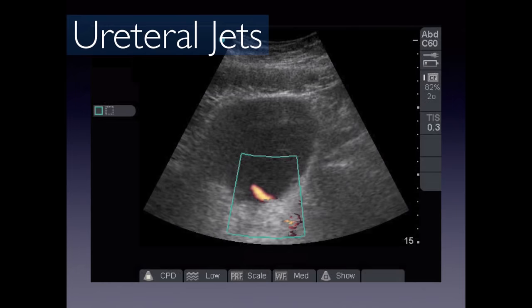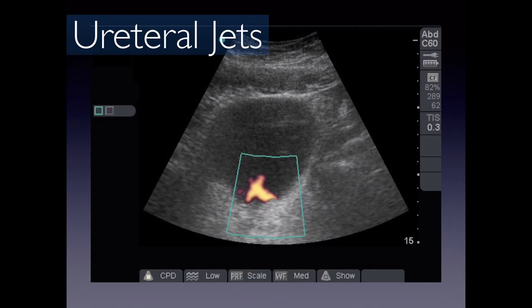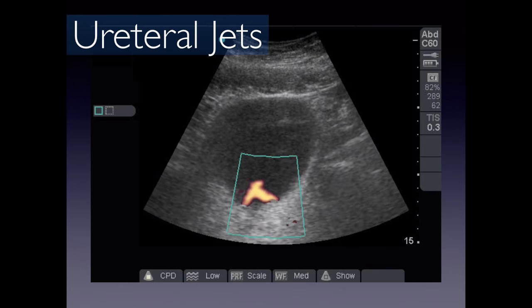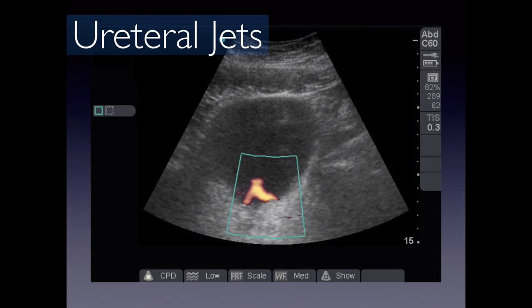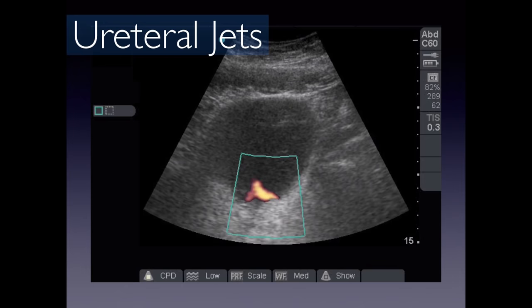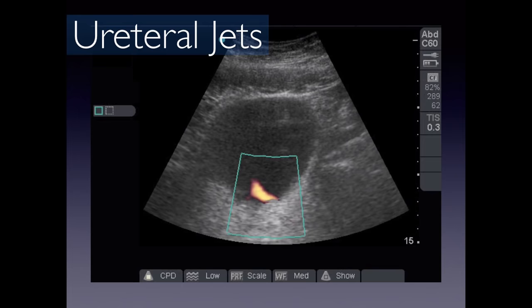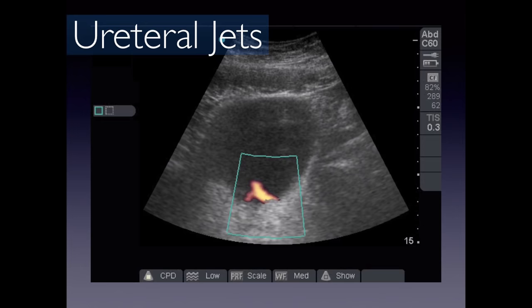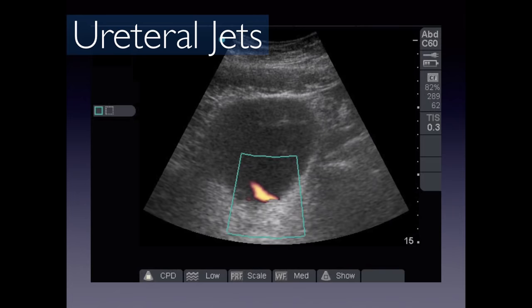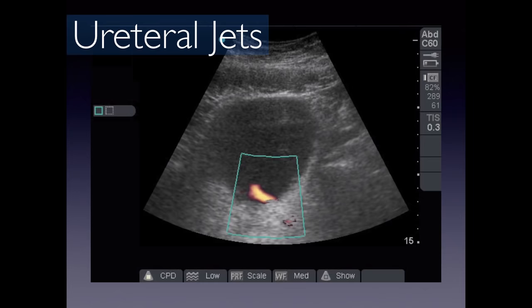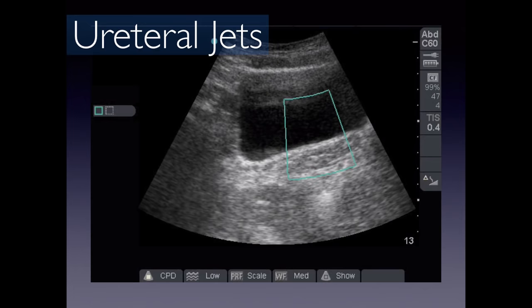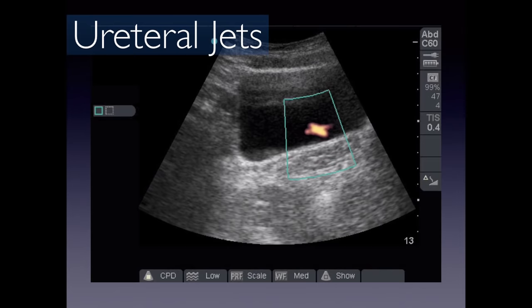Ureteral jets visualize urine flowing from the ureters into the bladder using color-power Doppler, which shows flow without indicating direction. Near the trigone of the bladder, you'll see the right ureter shooting diagonally towards the left and the left ureter diagonally towards the right. This confirms the ureters are patent. If one side had severe hydronephrosis or complete obstruction, ureteral jets should be absent on that side.